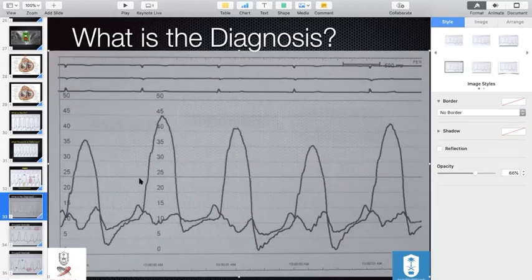Okay. So let's go back to the rhythm. You can see there's maybe a tiny A wave. Here is flat, but you see there is some peak here after the P wave. So assuming this is a low voltage, but I think there's a P wave. There's no extrasystoles. Pretty regular, so it's not like AFib. So I would say there's an A wave here, tiny, but it's not really clear here.